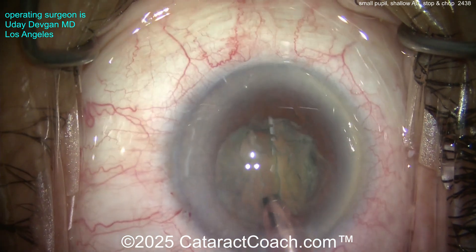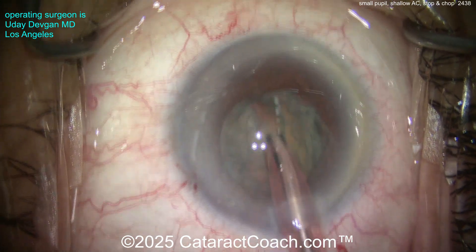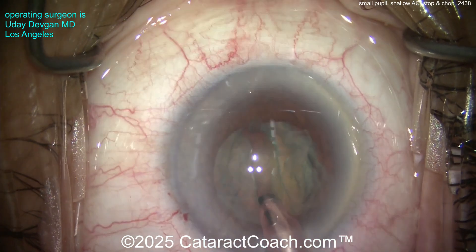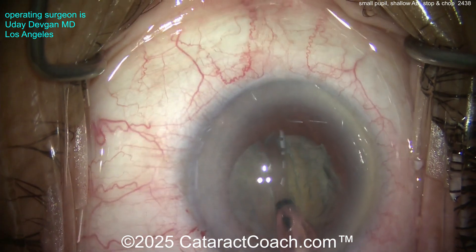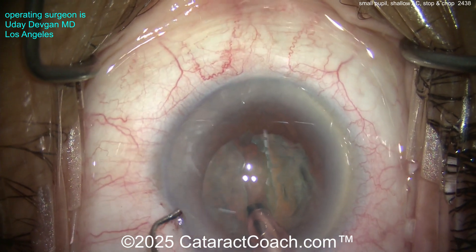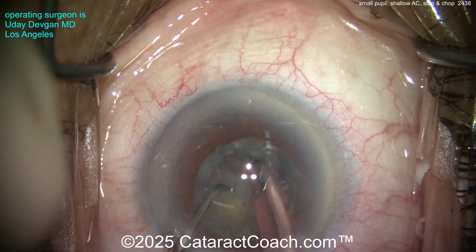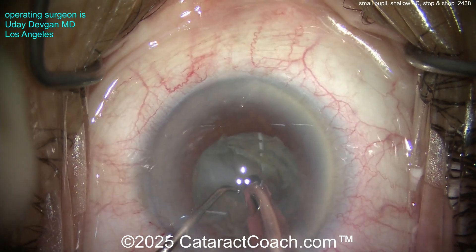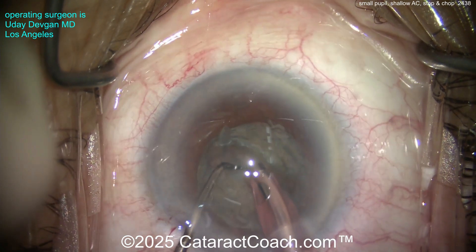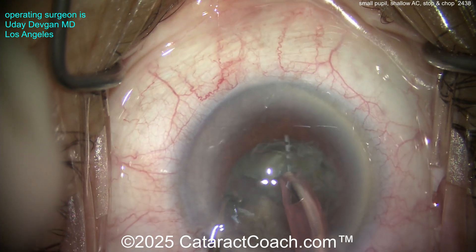You should know how to do phaco chop, stop and chop, and divide and conquer — why limit yourself? So here we go: a nice groove, taking my time, getting it sufficiently deep in the middle. This nucleus is like an M&M shape — a little deeper in the middle, a little shallower toward the peripheries. Now let's see if I can crack it and propagate that crack — there it is. I really want to ensure these two halves are fully split.